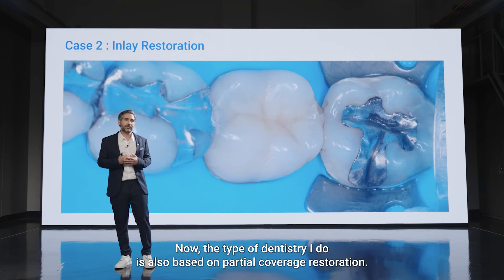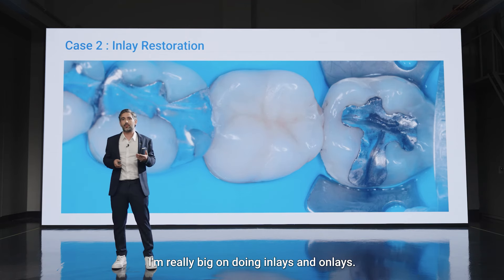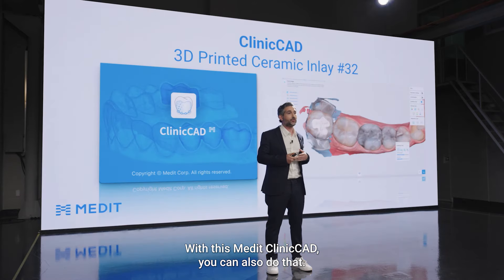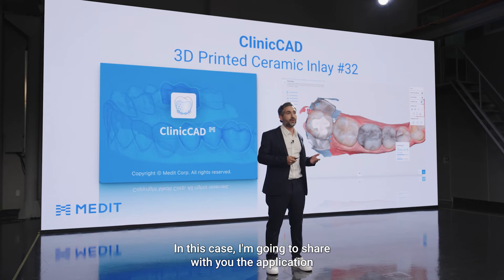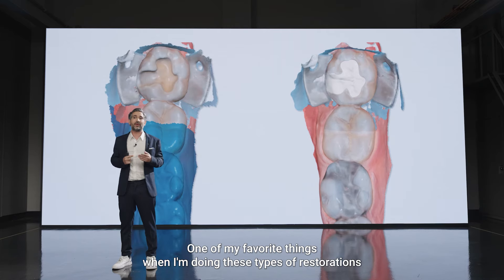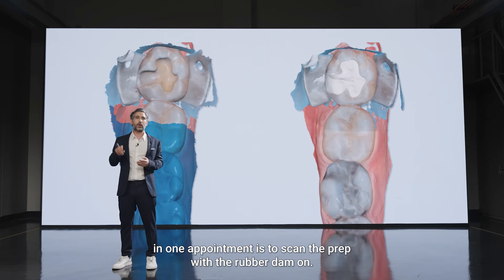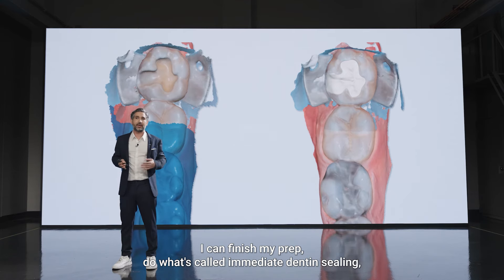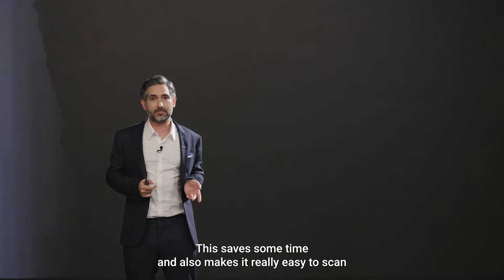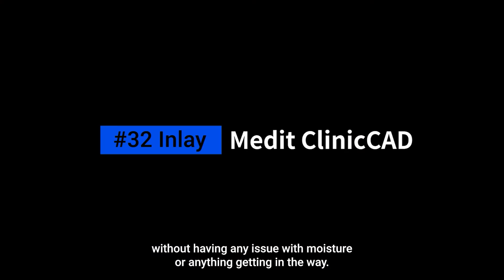The type of dentistry I do is also based on partial coverage restorations — not everything is a crown. I'm really big on inlays and onlays; that's what biomimetic dentistry is all about. With Medit Clinic CAD you can also do that. In this case I'm going to share the application of creating an inlay on tooth number 32. One of my favorite things when doing these restorations in one appointment is to scan the prep with the rubber dam on — I can finish my prep, do immediate dentin sealing, then scan with the rubber dam on, design, and save time.